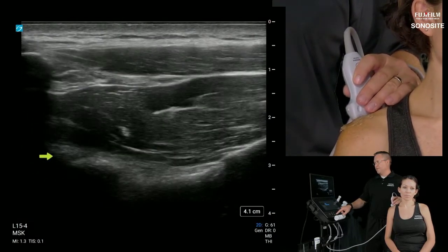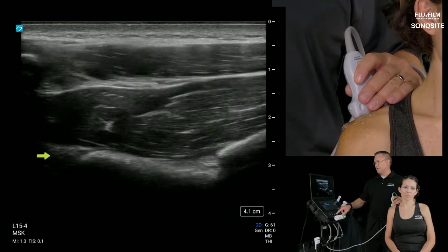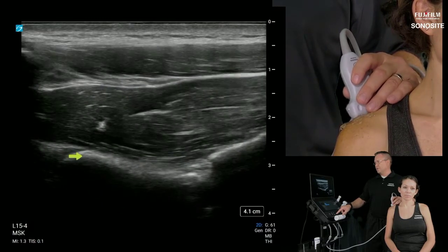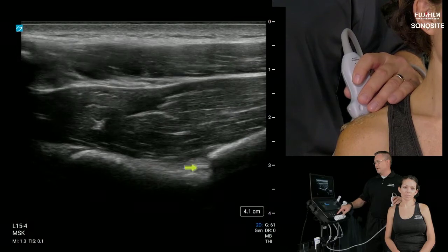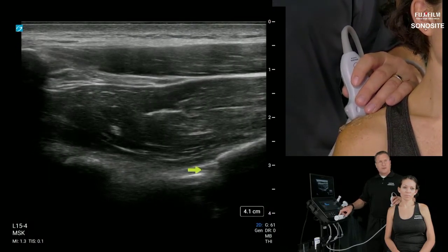You won't see that on everybody, but here's the shadow of the acromion. Here's superior labrum, kind of where the origin of the proximal biceps is. And then here's the superior glenoid tubercle, and then here's that neck of the glenoid, and then here's your suprascapular notch.